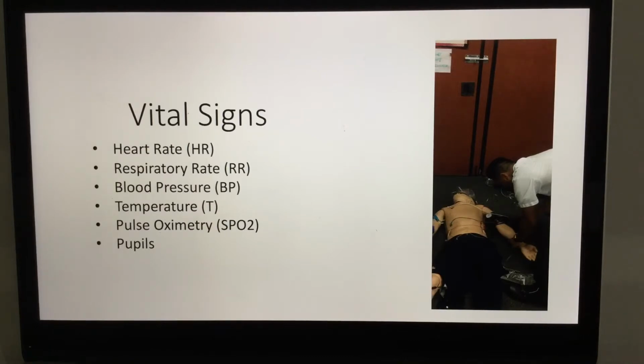Then we're going to release the pressure valve and let the air pressure slowly deflate out of the cuff. This takes some practice. If you let it go too quickly, the gauge will blow right down and you won't be able to get a blood pressure because the dial just moves too quickly, and the cuff will just deflate all the way down to zero. So we want to do it very slowly, sort of like the second hand on a clock, on your watch.